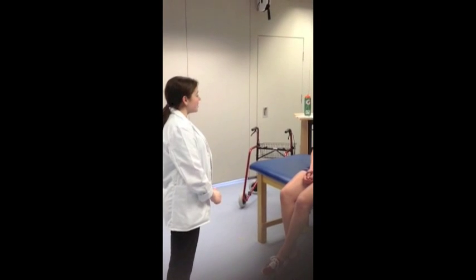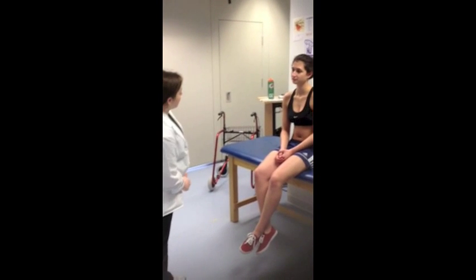The therapist should also instruct the patient to stop if pain occurs or if the shoulders move out of the frontal plane. The expected outcome of this lateral lumbar flexion: the normal range of motion is about 25 to 30 degrees again.